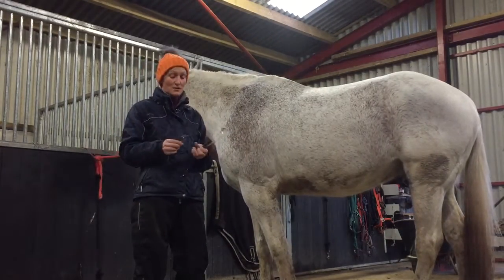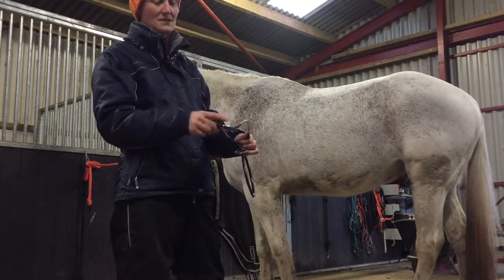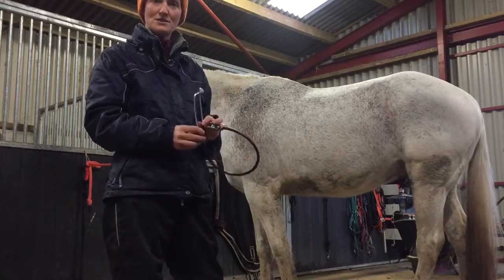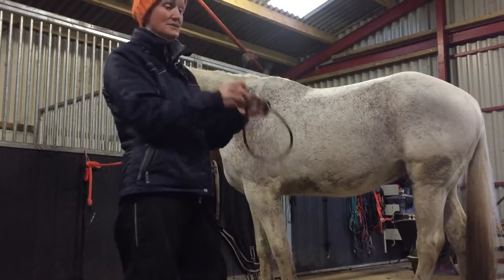This is a stethoscope, and most people don't know how to use one first of all. If you look at the end of it, the ear pieces are actually pointing in a specific direction. We need to make sure that we put it in our ears the correct way round, which is so that the ear pieces are pointing away from us as we look at the stethoscope.